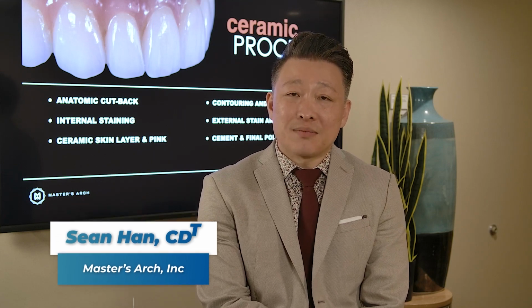So we're using CZR paste stain to create that contrast effect. And once they're done, obviously we're gonna go into skin layer and some pink layers techniques. And once the layer is nicely baked out of the oven, then you start doing grinding and separations, and also surface textures. I'm gonna show that. And finally, we're gonna go into external staining, also using CZR paste again. Then, in bonus to it, I'm gonna share with you my helpful tips on how I cement between the superstructure, which is KATANA STML zirconia with the ceramic layers, into a titanium bar.